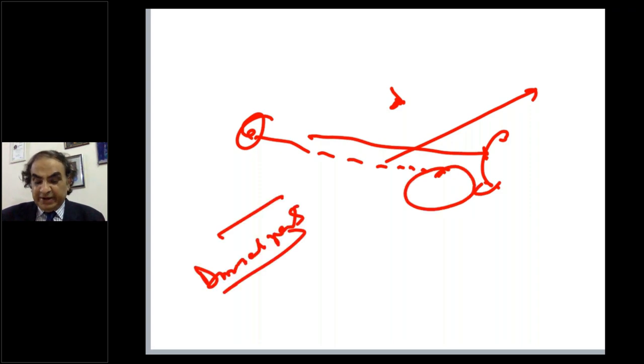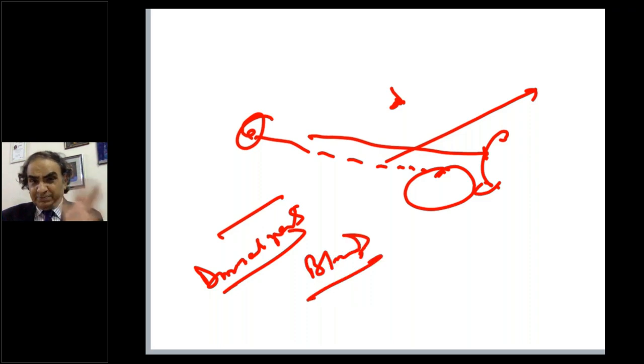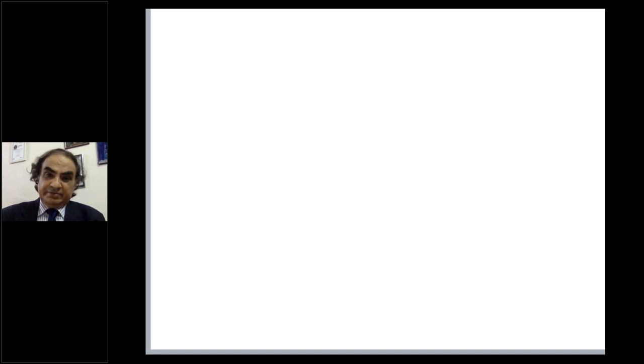Sometimes there is excessive bleeding due to carbon dioxide, but please don't take it as an important part. But importantly, the air embolism and the low pressures, which will happen because of features of an abdominal compartment syndrome type of picture. So that's where you need to abandon. What is the second part of the question? So when to abandon laparoscopy? Yeah, this is when you abandon it.